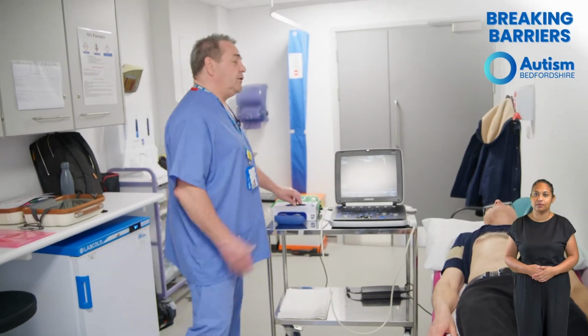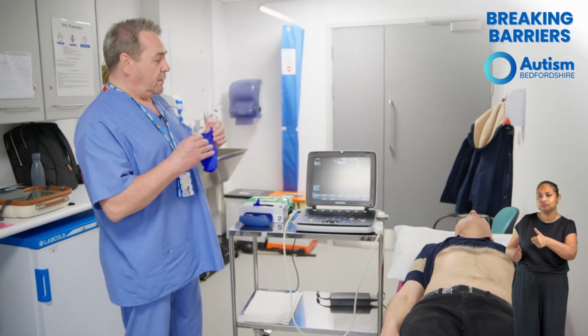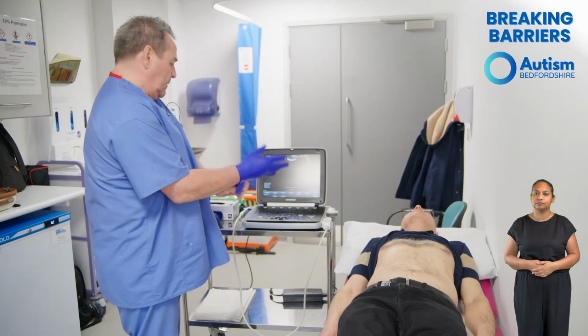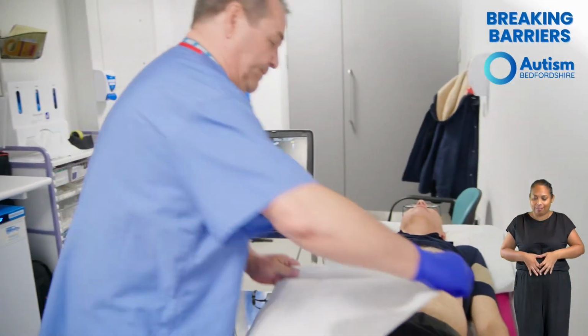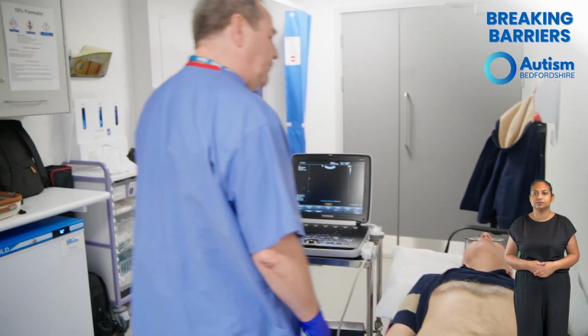Right, Richard, if you'd like to lay your head back for me and make yourself as comfortable as possible, I'm just going to put on a surgical glove. And I'm going to put a bit of tissue on your trousers so we don't get too much gel everywhere. Okay. Right, could you just confirm your name? Richard Jones. And your date of birth? 24th of May, 1960. Okay, thank you.